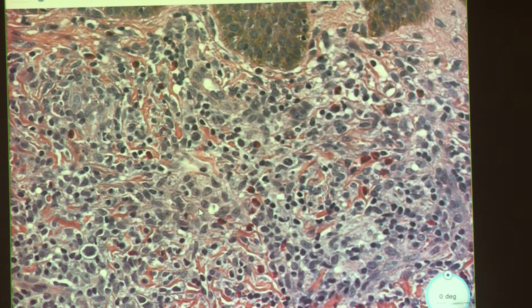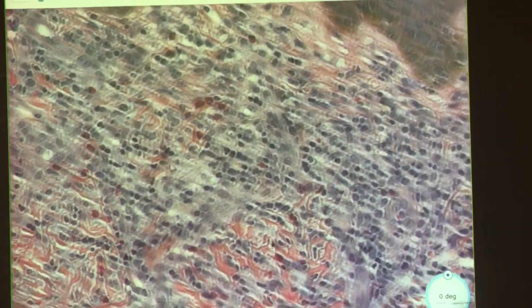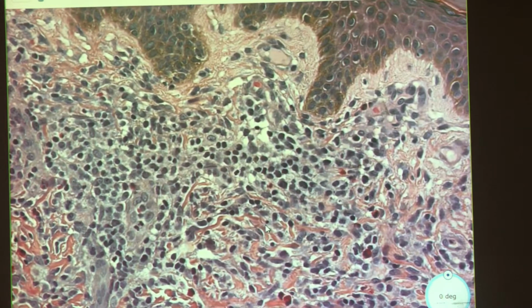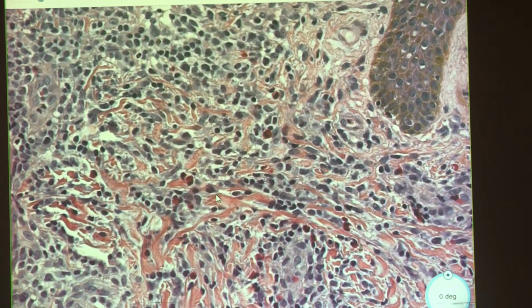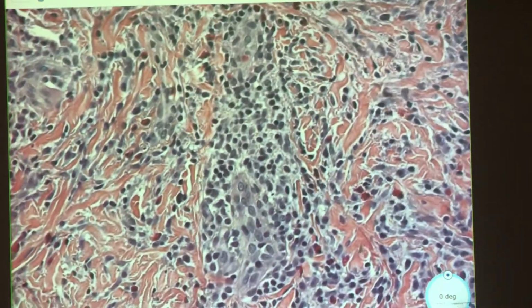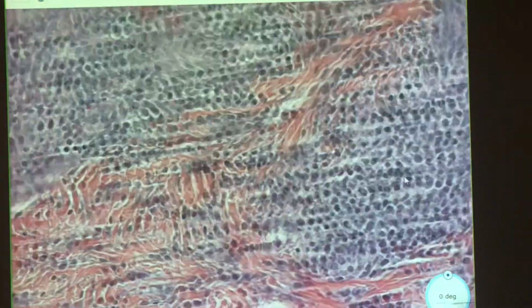And usually the cytoplasm is a bit more eosinophilic, but this is still okay. Maybe you see some of them if you squint. If you squint, turn your head about 30 degrees to the right. Use some imagination. Yeah. Maybe there's something there. Right there. And then, yeah, maybe a little bit here. Seems to be some sort of grooves, maybe. Maybe, yes. Maybe some of them are relatable to a beloved morning beverage around the world.